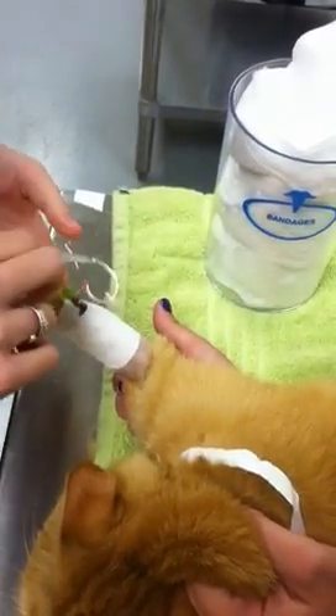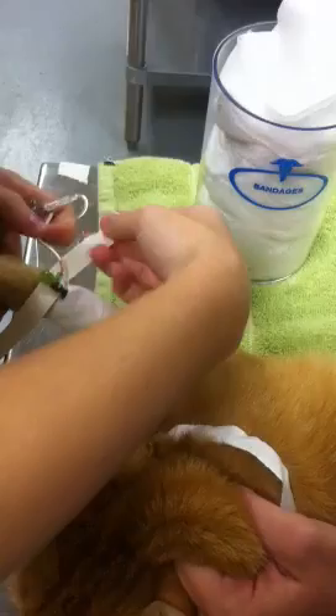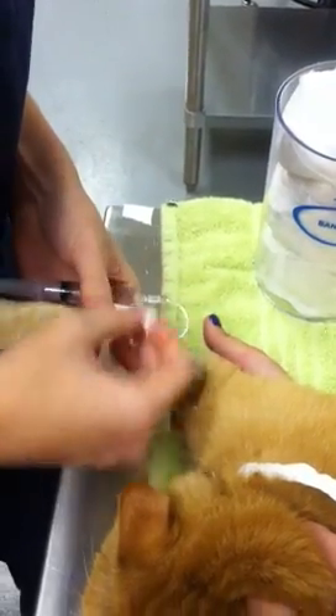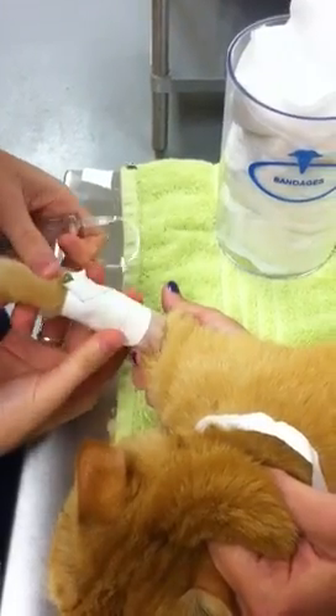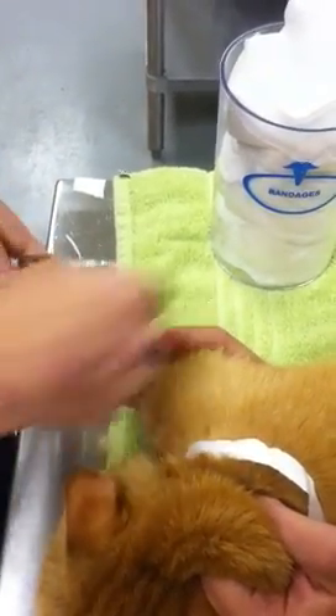My final piece on the actual catheter will be anchoring the T-port, making sure that I anchor this top side as well as the other side in a criss-cross fashion. Just to make sure that I'm still in, I'm going to flush one more time.